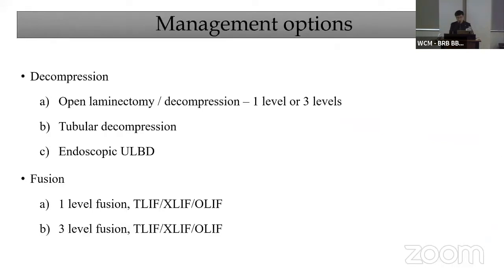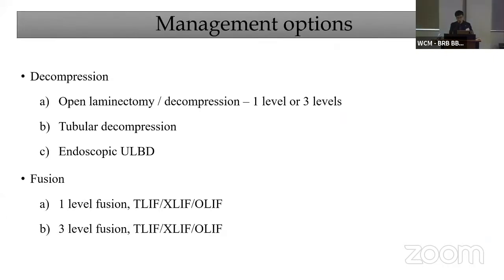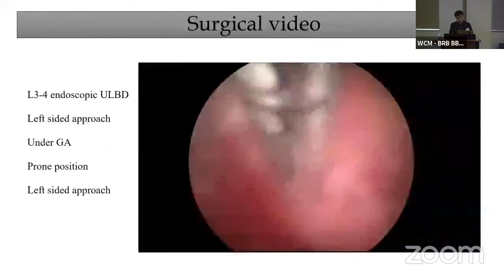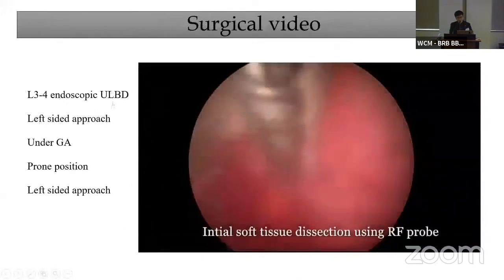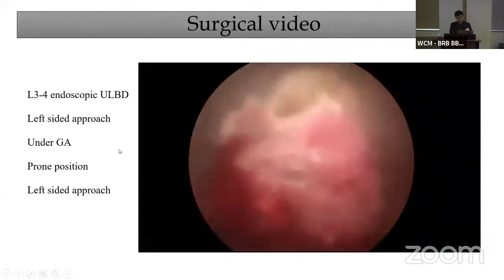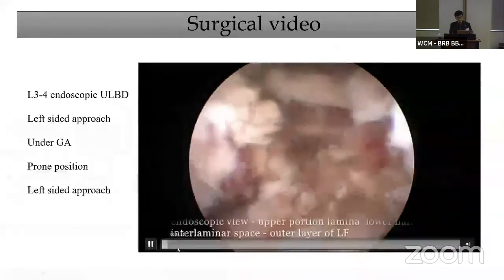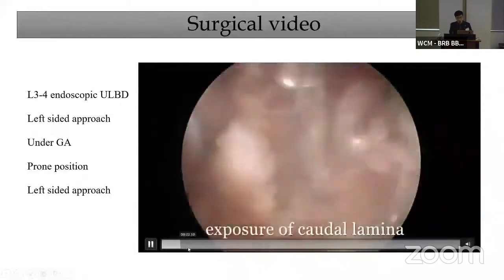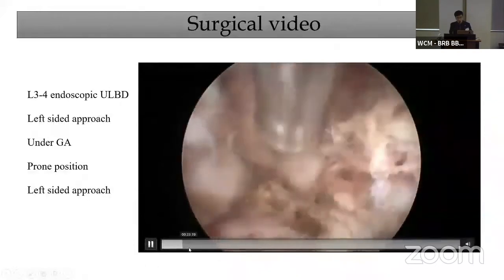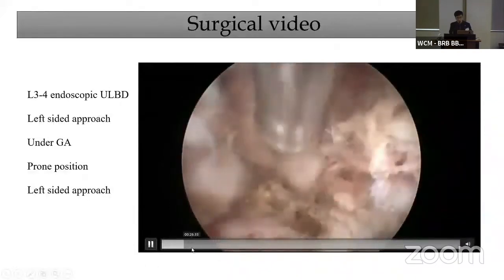We can step down the surgical procedure if we want to do the decompression — open, tubular, or endoscope. This is the surgical video. Initially we dock the tube over the lamina and expose the cranial lamina first.